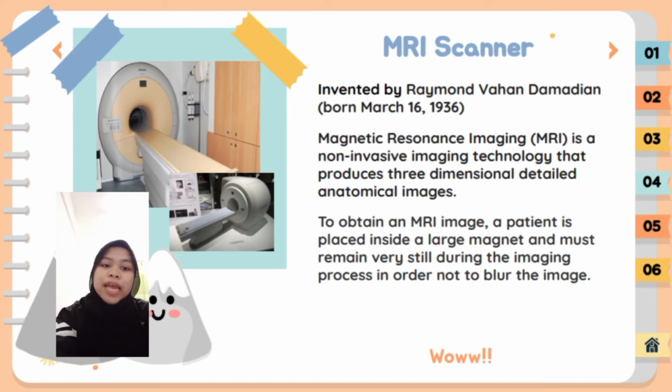He proposed the NMR, which means nuclear magnetic resonance relaxation, body scanner in 1969 and performed a full body scan of a human being in 1977 to diagnose cancer.